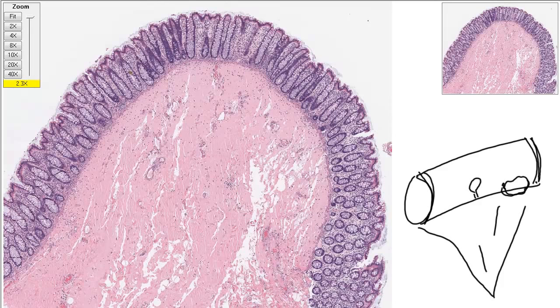Yeah, makes sense. So the polyp can be found also in a piece of colon removed, and a polyp is something that just sticks up. It's just sticking up. Okay, so any tissue that kind of sticks out like that. Yeah. It's not necessarily cancerous. No. So, for instance, another common place you hear about is some people in the sinuses might have sinus troubles, and they'll have a sinus polyp. Those almost always are just inflamed.